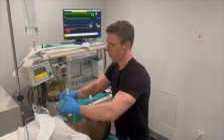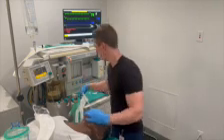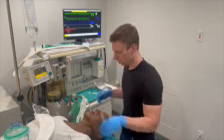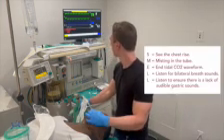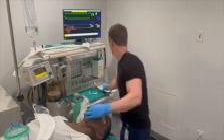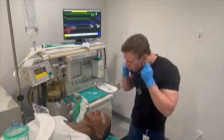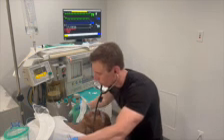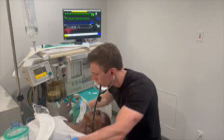This provider did not scissor the mouth and contaminate their glove. However, if that mouth opening method was utilized, the dirty glove would be removed before touching the anesthesia machine to prevent contamination. We will use the mnemonic SMELL to confirm a proper tube placement: S for seeing chest rise, M for misting in the tube, E for an end tidal CO2 waveform. The first L stands for bilateral breath sounds, listening on the lateral side of the chest towards the axilla. The last L stands for lack of audible gastric sounds.